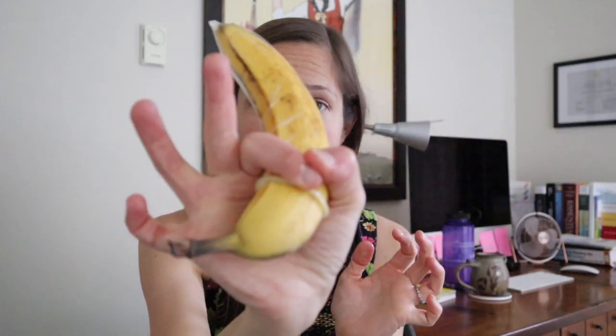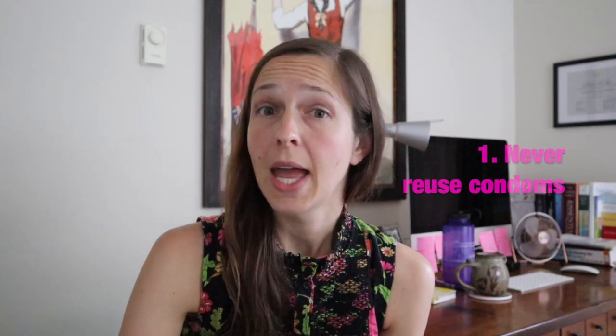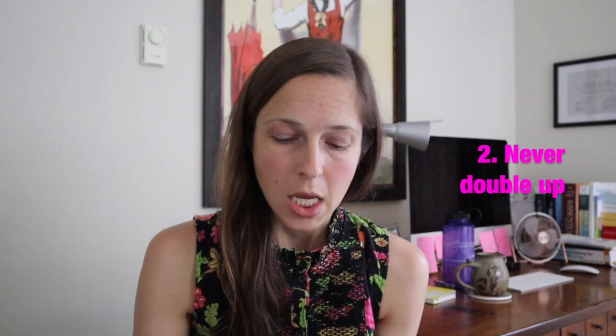There you go — condom on, with a little extra material up here to catch the ejaculate or semen. It fits pretty well on this banana. When you're pulling out, grab the base of the condom to keep it on the erect penis, then pull out and remove the condom. Throw it away. Never reuse condoms, and never double up on condoms — doubling up can cause friction and cause them to break, which defeats the purpose.